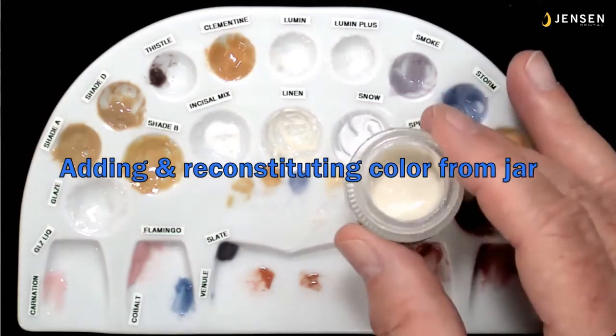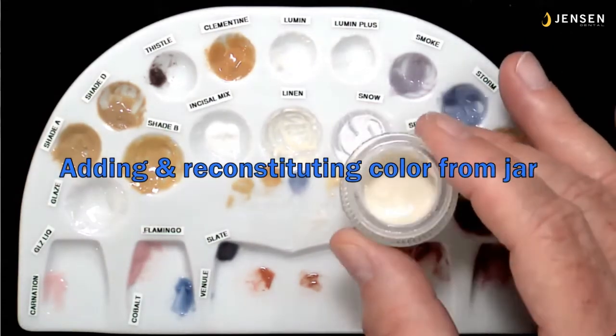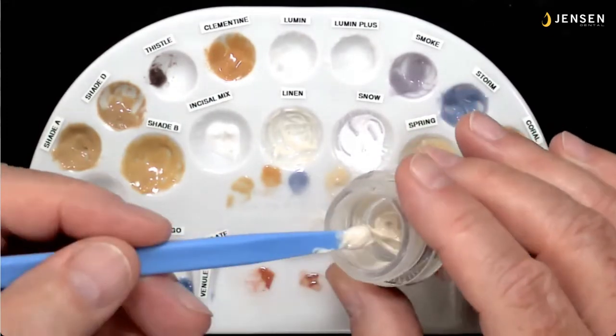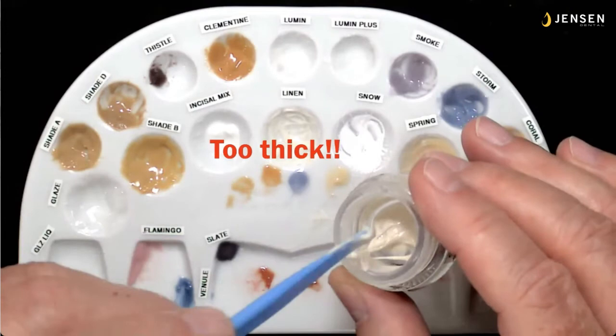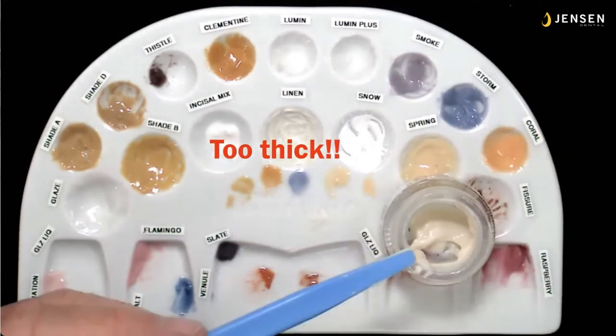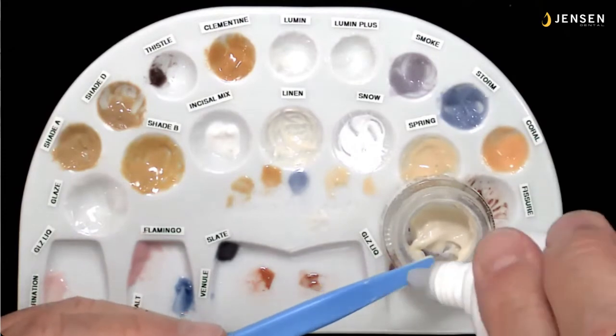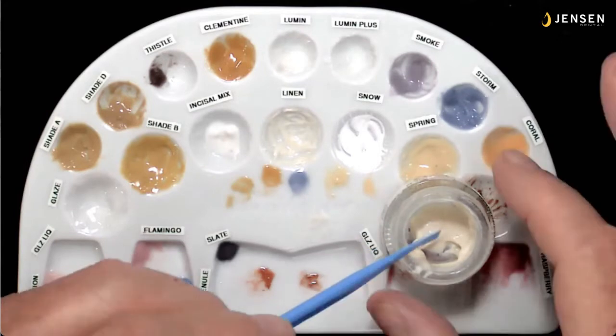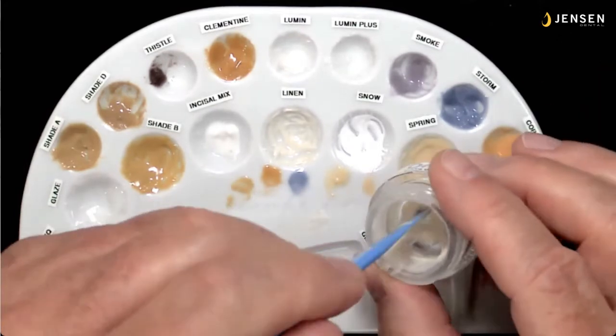So I'm going to show you adding and reconstituting color from a jar. What I have here is the linen, and you see it's a little pasty right here. It's kind of like chewing gum. Remember, it's too thick if it's like chewing gum. You want it to be kind of like honey or molasses. So what I'm going to do is use a colored spatula. I've got less than half a jar of material here, so I don't want to put in a lot of liquid.